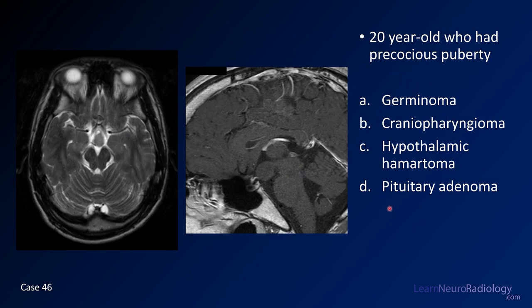Case number 46 is a 20-year-old with precocious puberty. We have a T2 and a post-contrast — the post-contrast has enhancement of the nasal mucosa and a little enhancement of the vessels. Your choices are germinoma, craniopharyngioma, hypothalamic hamartoma, or pituitary adenoma.